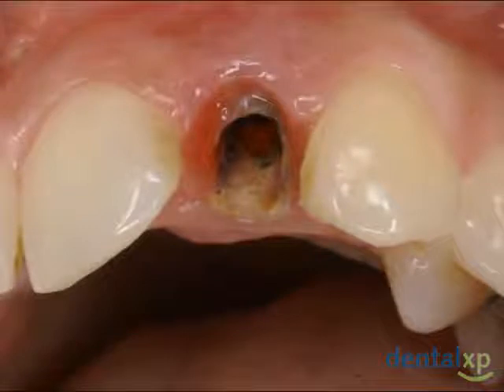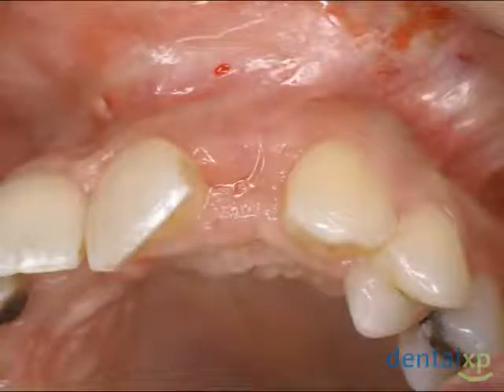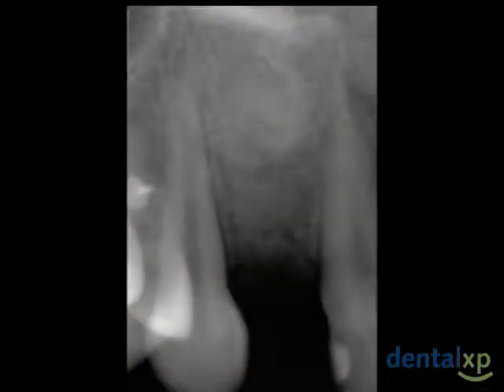Once again, the previous slide of the preoperative image of the severely decayed and broken down maxillary left lateral incisor. You can see how we've been able to perform this procedure, and this is at approximately 8 weeks post-operative healing, the maintenance of an intact ridge with good mesial-distal and buccolingual volume, as well as an enhancement of the keratinized gingiva. You can see the wound healing with the new bone graft and collagen, BioOs collagen, being incorporated into the surrounding bone. And then approximately 5 to 6 months afterwards, we go ahead and place our dental implant.